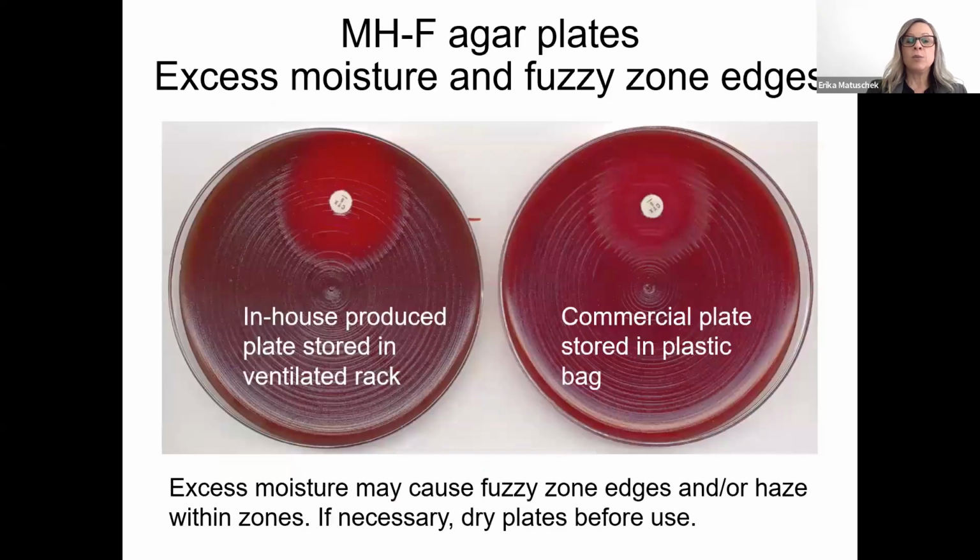I'm not sure if you can see it well on this picture, but I will explain it to you. This is a Haemophilus influenzae QC strain, which is susceptible to cefotaxime, and cefotaxime is the disc put on this plate. We have used the same inoculum suspension on both plates and treated them exactly the same. The plate to the left is an in-house produced plate. It was only stored in a ventilated rack in the fridge. And then to the right, you have a commercial plate. Both plates were allowed to reach room temperature, but they were not dried specifically.